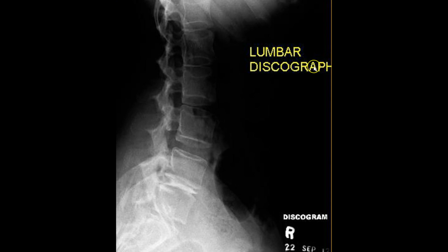And we've been talking about the intervertebral disc, so I wanted to make mention of this technology, discography. This is oftentimes termed a provocation discogram. And what it is, it's technology whereby, usually under fluoroscopic guidance, contrast material is injected into the disc. Now, this used to be used to diagnose disc herniation. So radiologists would assess patterns of contrast extravasation. It's no longer used for that so much as it is used for symptom provocation. This is in the realm of putative diagnoses of quote unquote discogenic pain and really surgical planning.